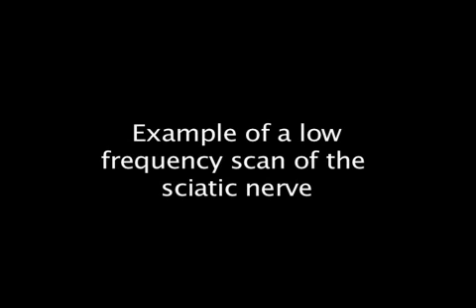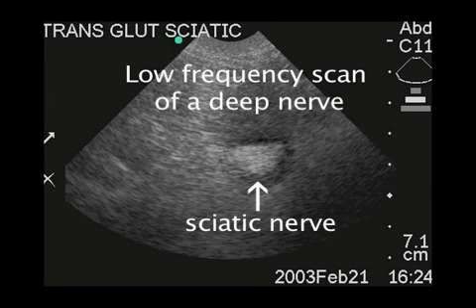In contrast, the following is an example of a low-frequency scan of a deeper structure, the sciatic nerve. Notice the depth, and also notice how there is less detail with respect to this nerve. The nerve is less distinct.